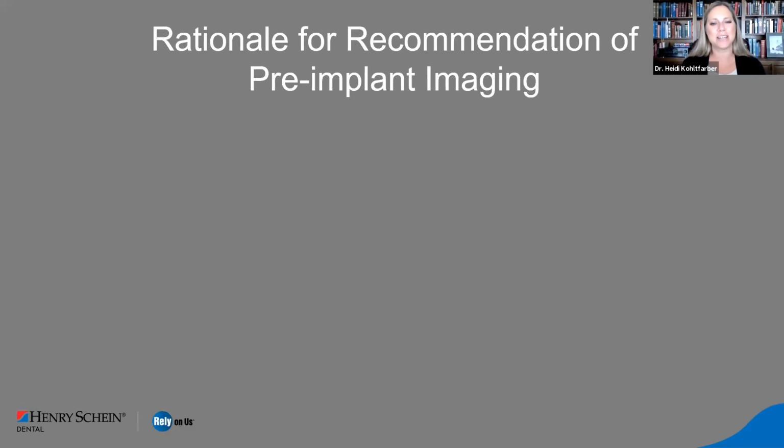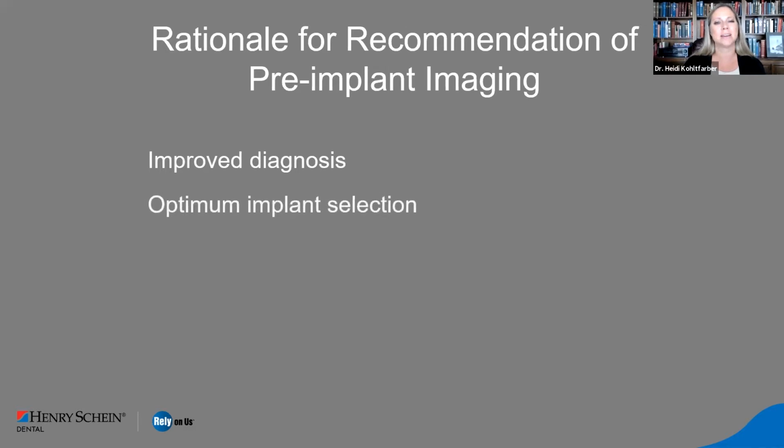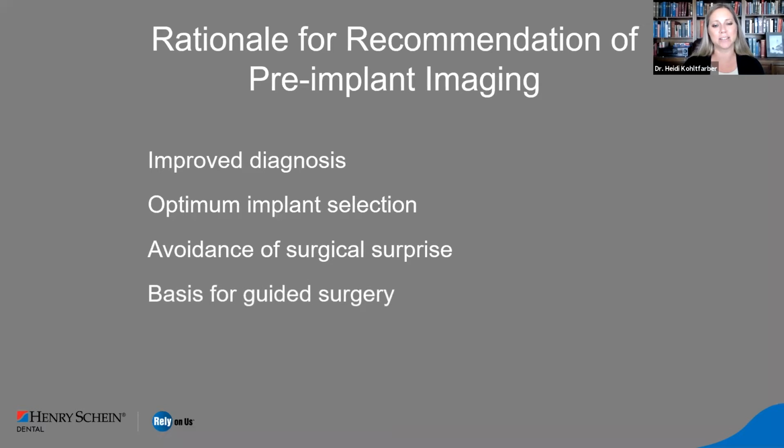Rationale for a recommendation of pre-implant imaging. As we know, we all want to take some pre-implant imaging. Why would we want to do that? Well, it's going to help us to improve our diagnosis. It allows for optimum implant selection, avoidance of surgical surprises, and becomes a basis for our guided surgery. It's also incredibly important for medical legal documentation.